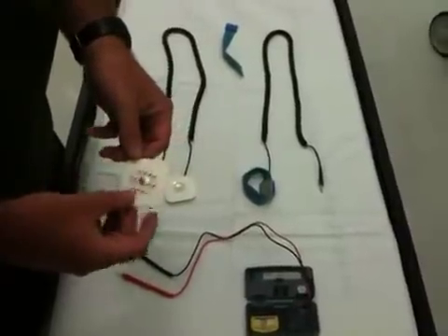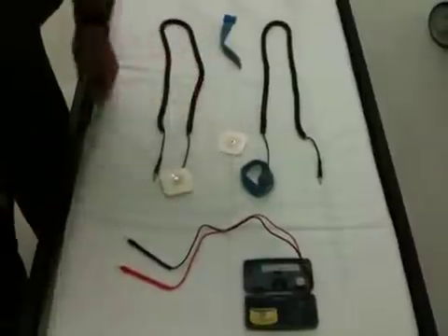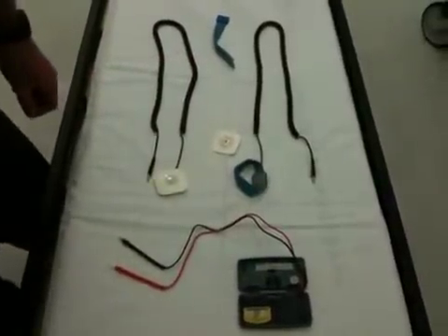Instead, at my center we use the 3M Red Dot EKG pad. It works very well. It's a one-time use — you throw it away when you're done.